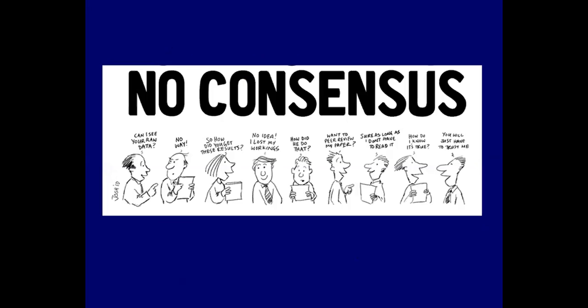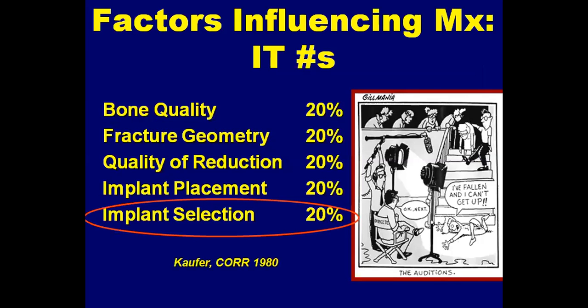So there is no consensus about the proximal thickness of the nail, about the number of the hip screws, about the number of the locking screws, about the direction of the locking screws. There is exactly no consensus. So they're still in the phase of evolution, while the DHS has at least decades of track record, while PFN or intermediate nail, every 5-10 years it's evolving with the nail or blade or plate or screw. They have not decided how to go ahead.